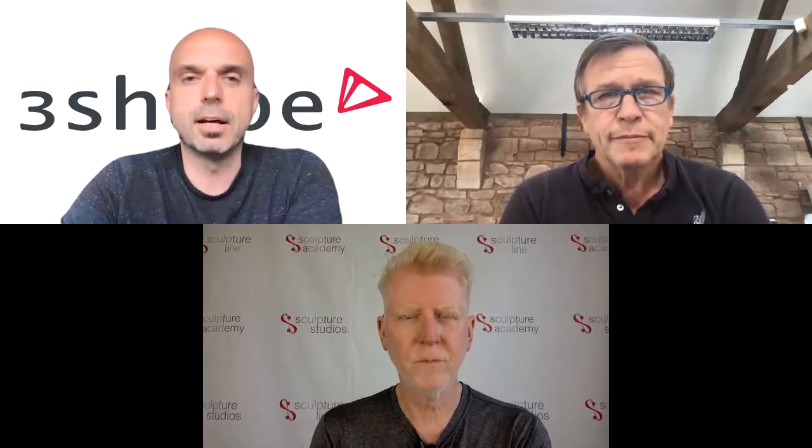Sure. I'm going to take the scan from you, Ian, and all the pictures we need as well. And then I'm going to start doing first of all, the analysis, the aesthetic analysis, make the 2D smile design with the 3Shape software. Send it back to you to engage the patient, see so everything is okay, just to have a communication tool. And then, of course, when everything is approved, we go on with a 3D mockup and design the wax up basically in the 3D, and create the models for you, so you can just put it in the printer and send it back to you.